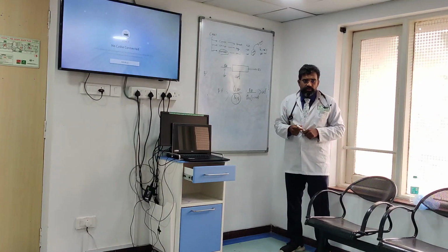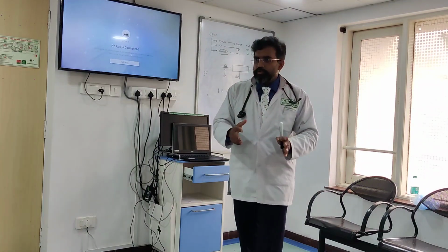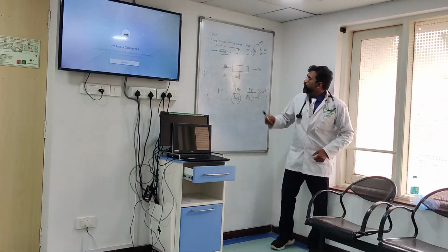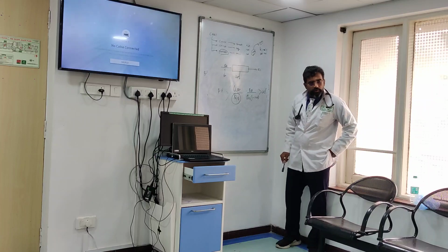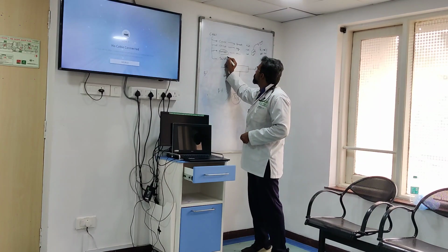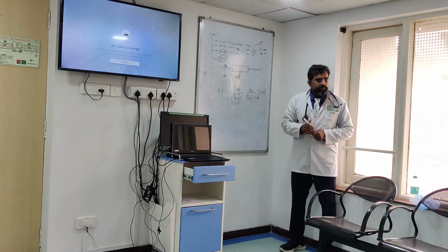Let's put up a dose. The dose has to be 25 to 35 mL/kg. Now you tell me, Nikhil, what modality would you like to use here? You have got 3 modalities in front of you. I can put one more for you. I'll put SCUF also here. Slow continuous ultrafiltration. Now you understand what is ultrafiltration? It's just removal of water. Which of these would you use?